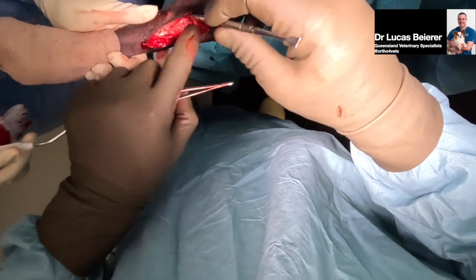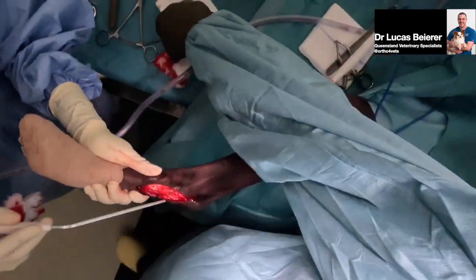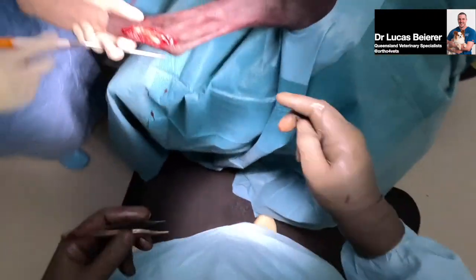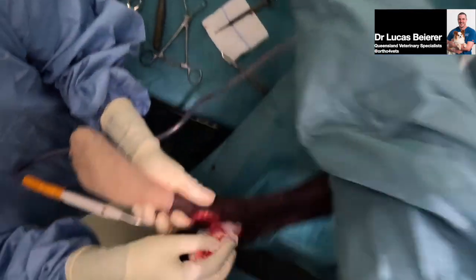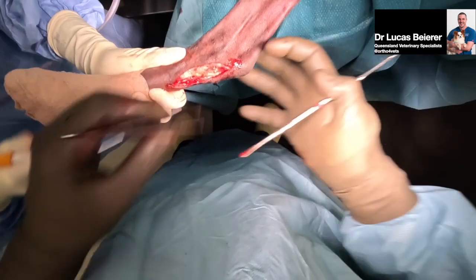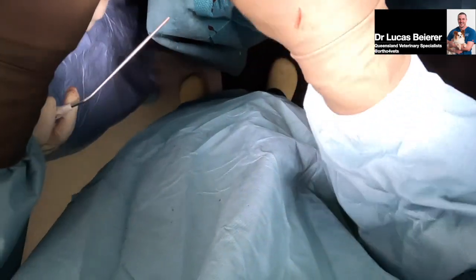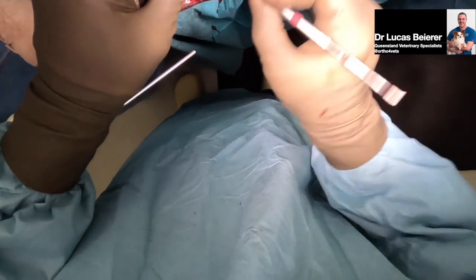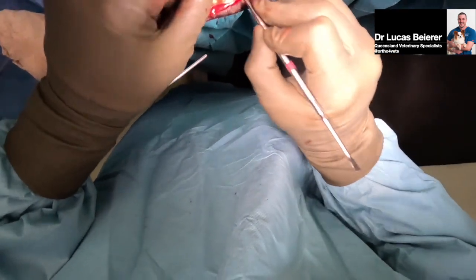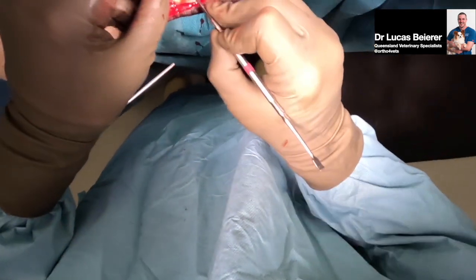So you see that little calcaneal fragment coming into play, and it's not really part of the weight bearing component of this repair because our plate's going to be more caudal or plantar in position, but I think it makes sense to try and put it back on if we can. Hopefully without creating too much soft tissue harm.